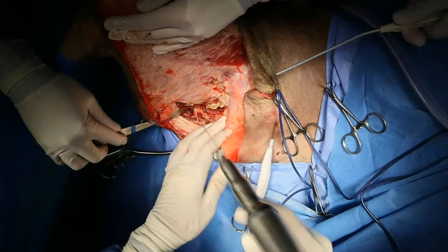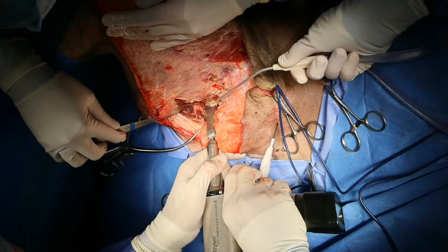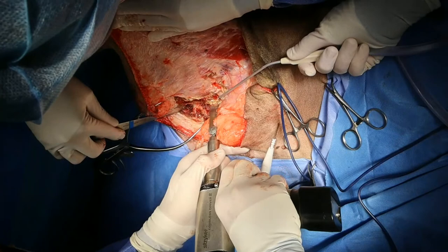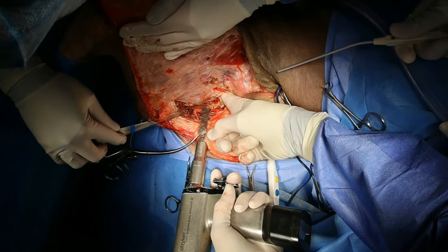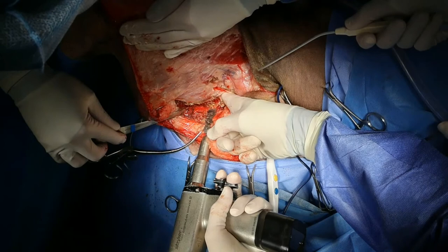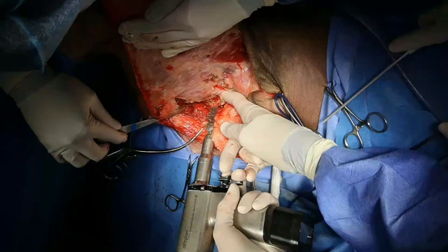Just going to start cutting that before. So I'm just going partial thickness. So now, because I've gone partial thickness, I've got a guide now for my blade. Okay, so I can feel that on my finger. A little bit tickly on my finger as the blade hits it.